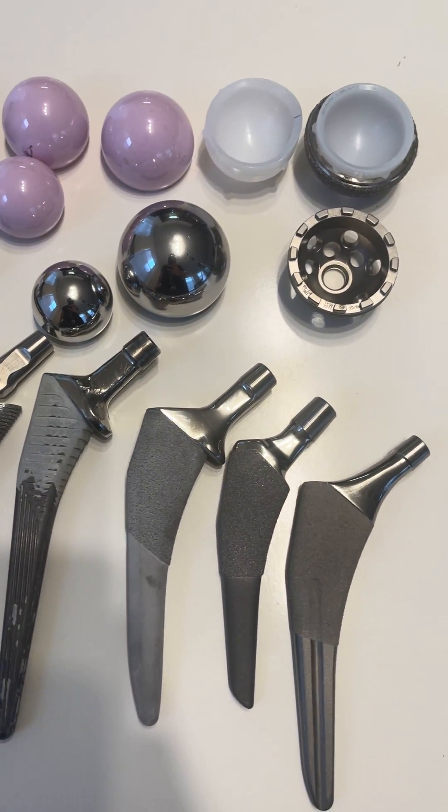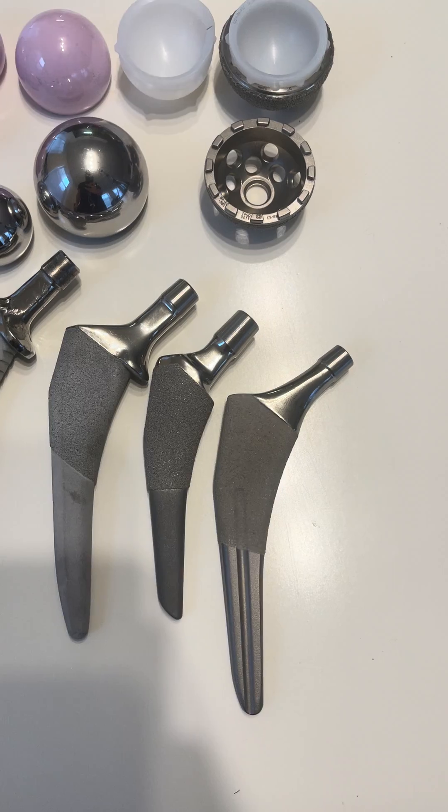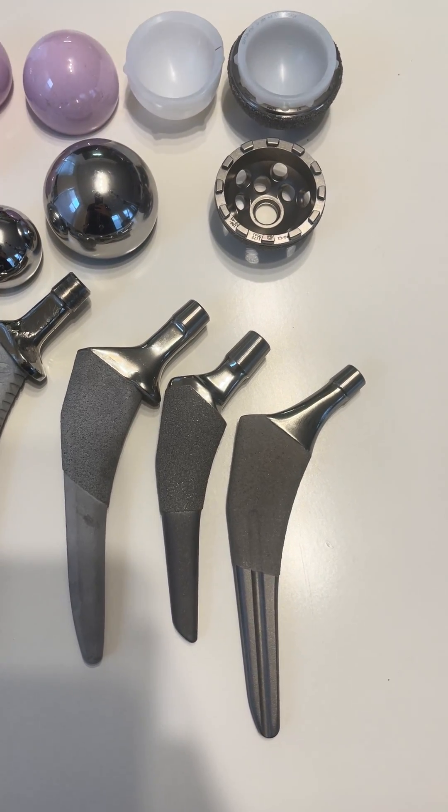This is a question I keep getting: there are so many different stem designs — how do you know what to put in for a hip replacement? So I'll go through them and talk about these stems a little bit.